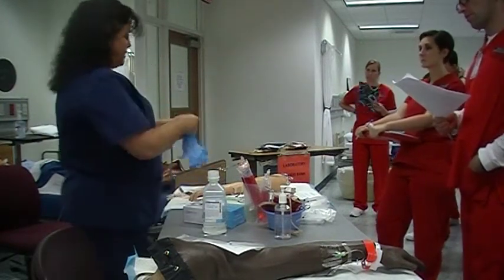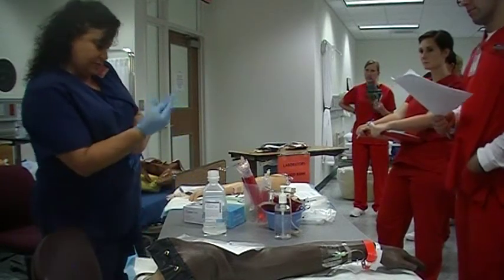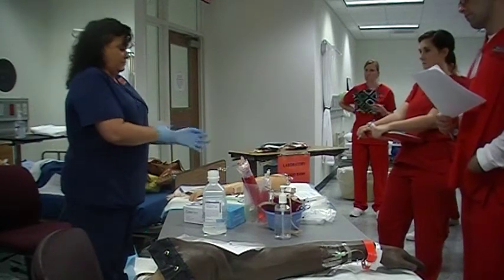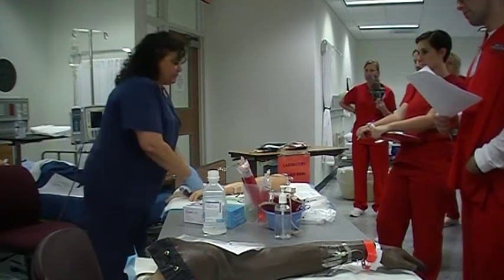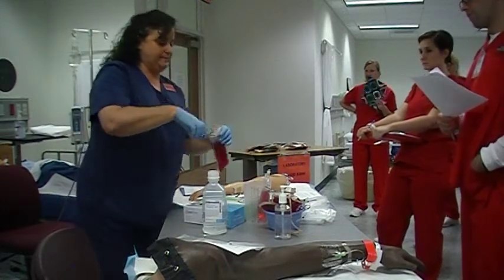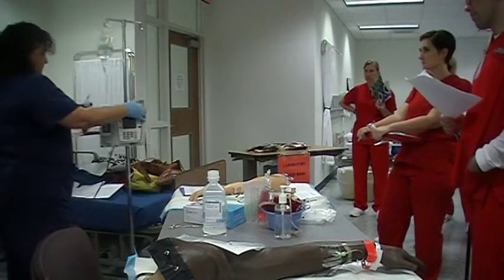And we're going to spike our blood. So we won't use any of the ones that look like they haven't been spiked. I'm just going to use these again, okay?